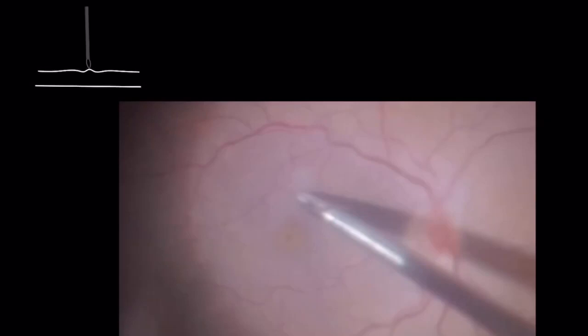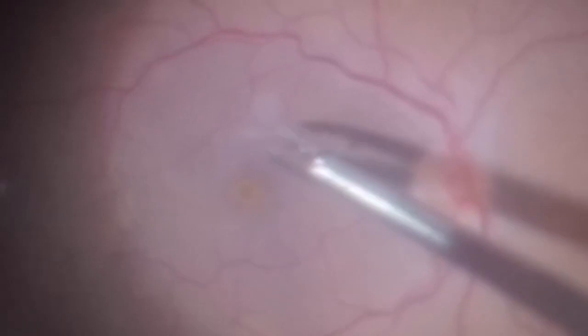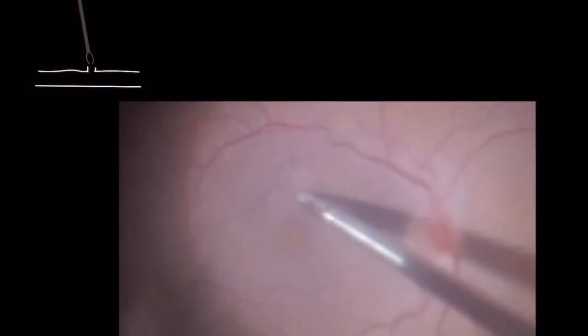To start peeling, pinch the ILM with the forceps, make a tiny movement upward and then release it. This way you are able to separate the ILM from the underlying retina and to create an edge.